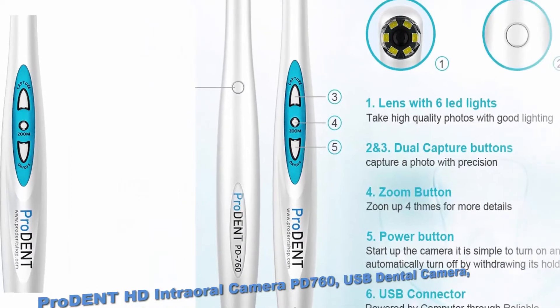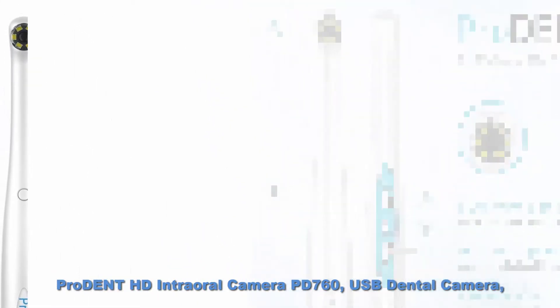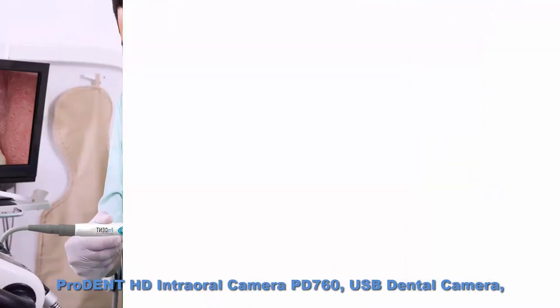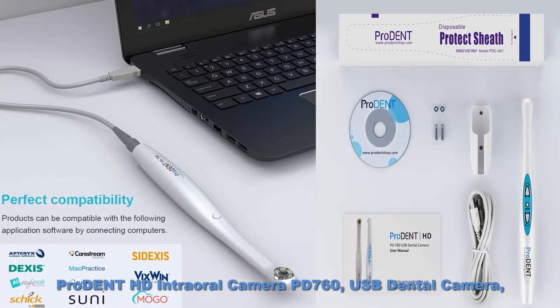Top 2: ProDent HD intraoral camera PD760, USB dental camera. Capture button works with Eaglesoft, Dexis, Carestream, and most imaging software. ProDent HD intraoral camera provides 720p high quality, super clear images.